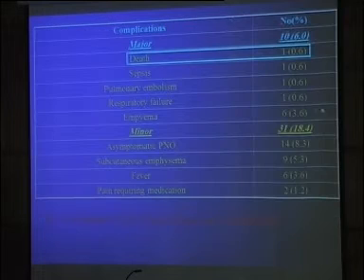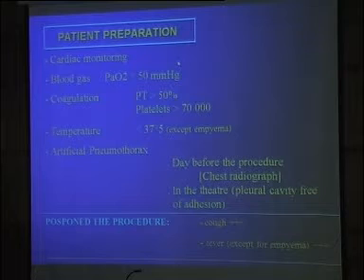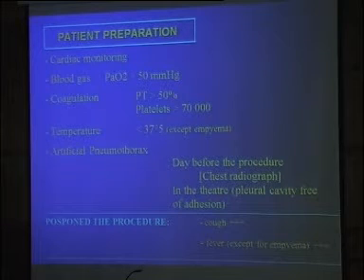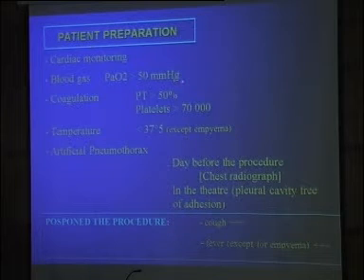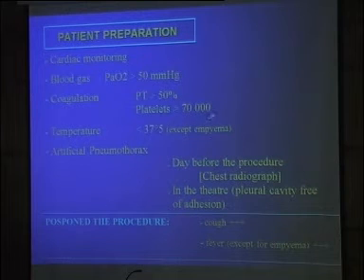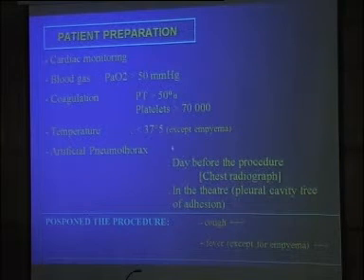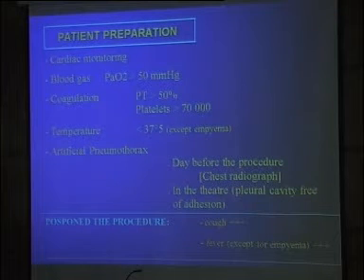But we used to perform this procedure under cardiac monitoring. We try to be very cautious in patients with PaO2 inferior, of course, to 50 millimeters of mercury. Coagulation has to be correct, in particular taking into account the platelet counts. We try to postpone the procedure in case of febrile patients.